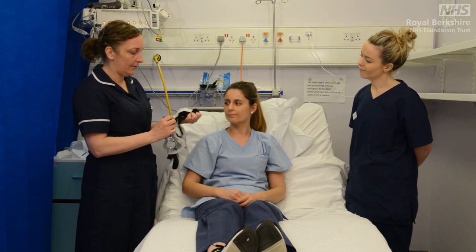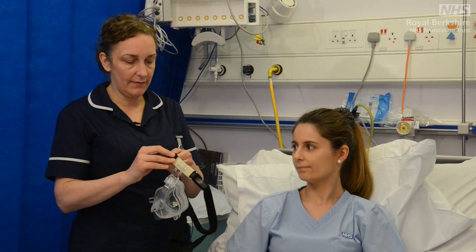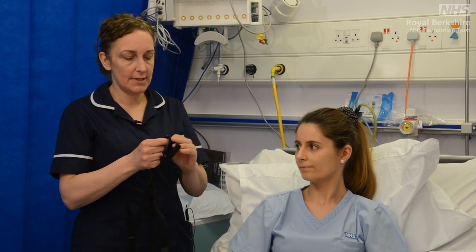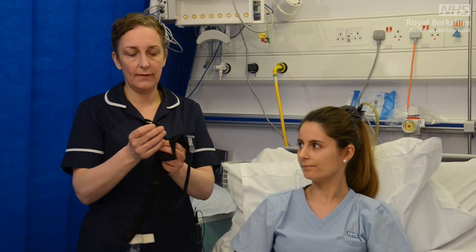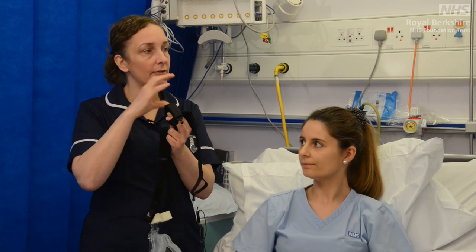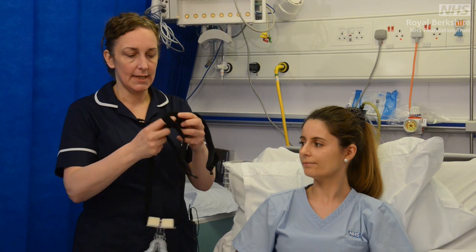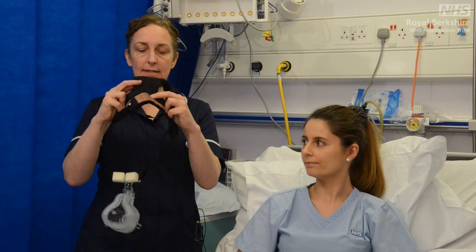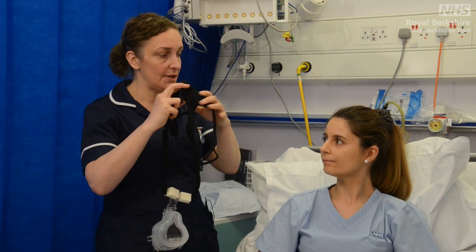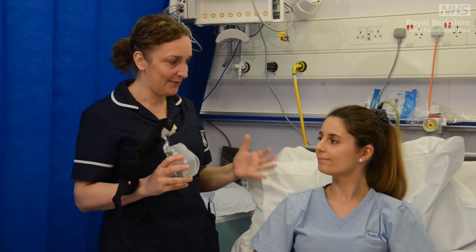You can see the top straps are connected onto the mask here — just a very simple Velcro release system. Then the bottom section of the mask, again just loosen them off a little bit. You can see on these ones they actually have a ball socket, which is really useful when taking the mask on and off once we've fitted it, so you don't have to keep undoing the straps. The other section of the harness is this section here, which we want sitting on the crown of the head so that we can make sure the straps are in the right place.